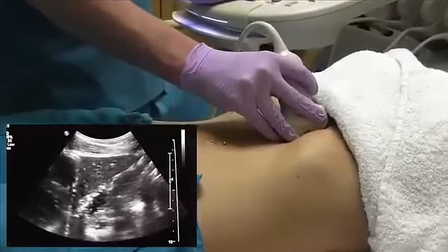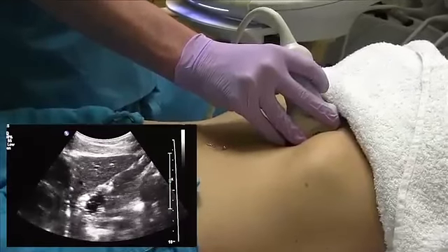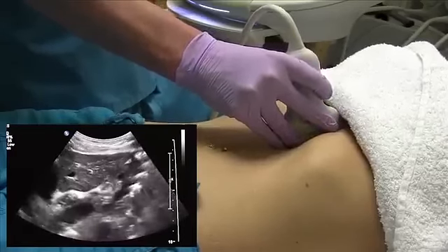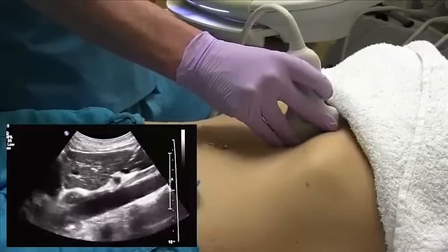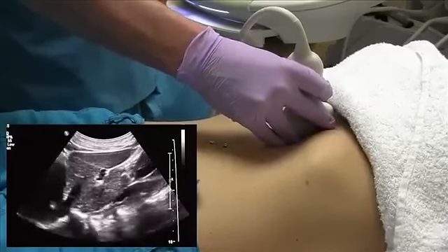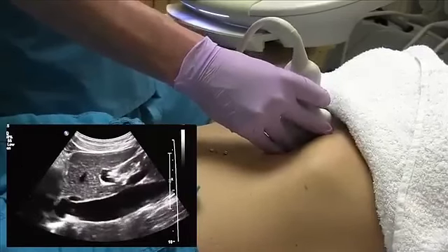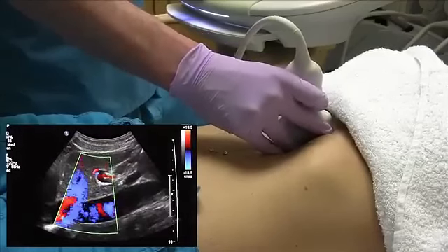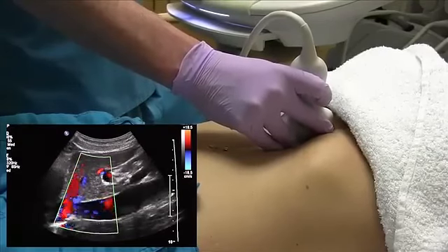First picture that I usually take is the lateral left lobe. Next picture, we come through more medial, and you're going to start to see the aorta come into the picture here. This is my next picture. Still sweeping more medially, you're going to start to see the IVC, and you'll see the caudate lobe. And we usually put color on the IVC just to make sure that it fills completely. This is our last picture of the sagittal left lobe here.